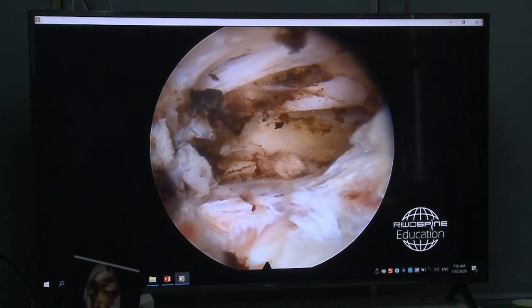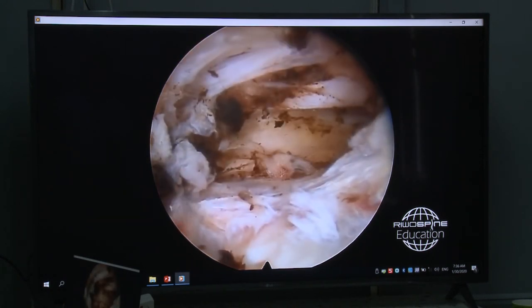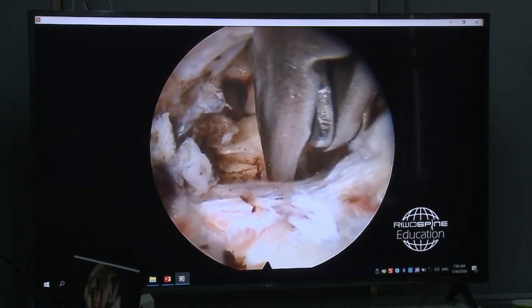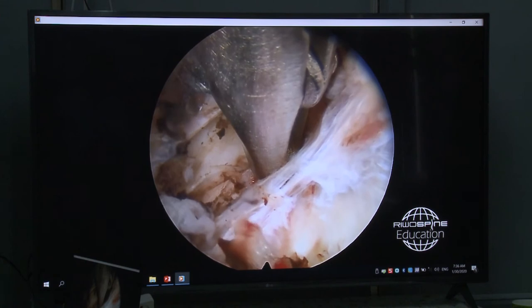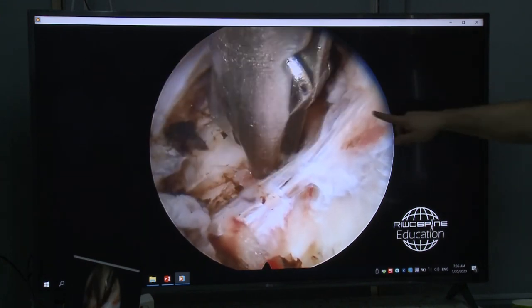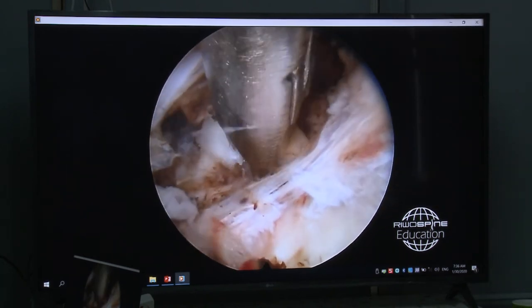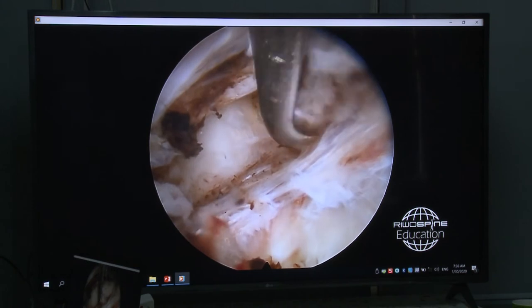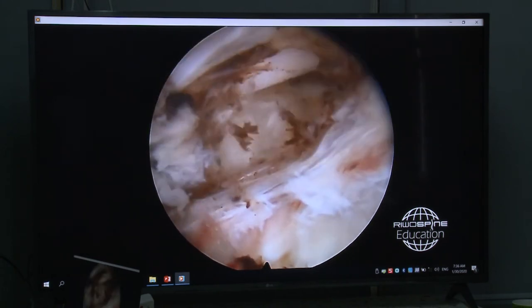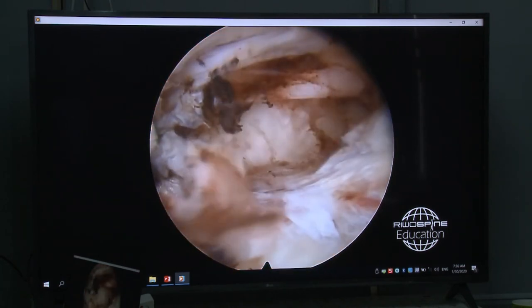Now I cut into the herniation, and as I told you, when I want to cut into something and open it, I cannot see what I'm doing. By rotation of the endoscope, I see what I'm cutting. So now I'm cutting. You see the root there? So rotation here and cutting into the herniation.